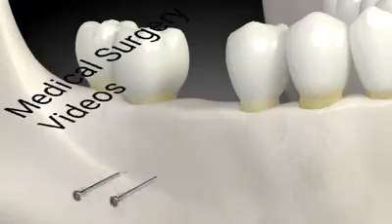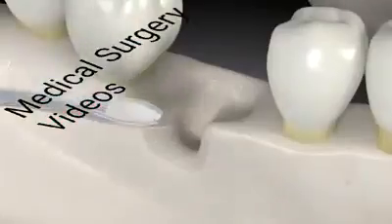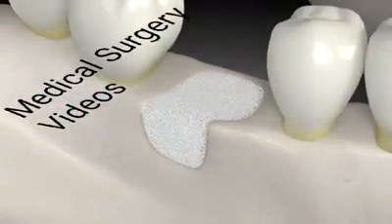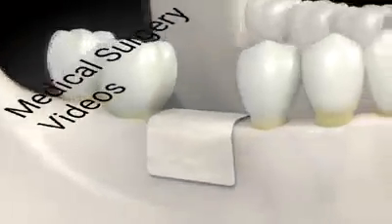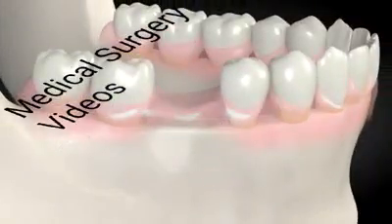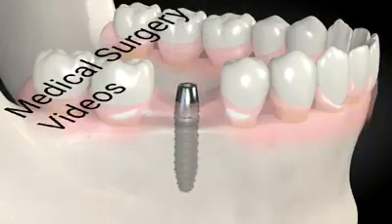When the bone heals, there is plenty of bone for a dental implant. When it is not possible to use a block, a softer mix of bone substitute is placed where bone is missing and covered with a membrane. This graft also grows bone. When the bone heals, a dental implant is placed, allowed to heal, and the final tooth is placed on it.